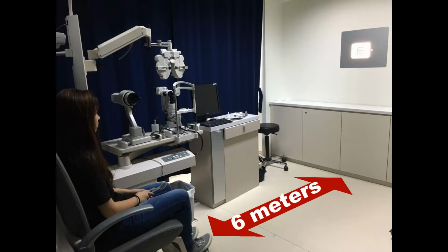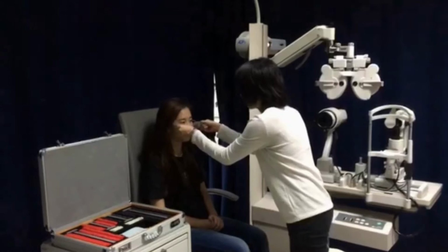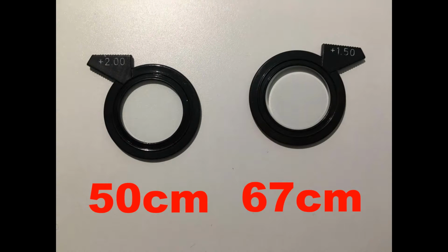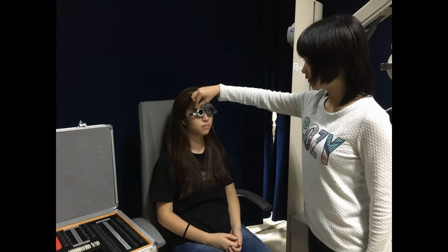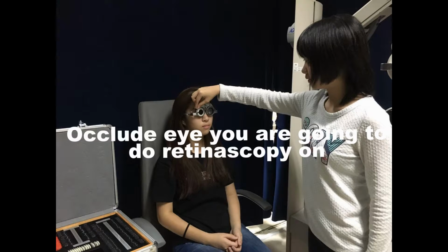The patient is to be fixated at 6 meters from a target. The accommodation of the patient's eyes is to be controlled by fogging. This is done by placing working distance lenses on both eyes of the patient. The working distance lenses are plus 1.5 diopter or plus 2 diopter for working distances of 67 cm and 50 cm respectively. After placing working distance lenses, occlude the tested eye.